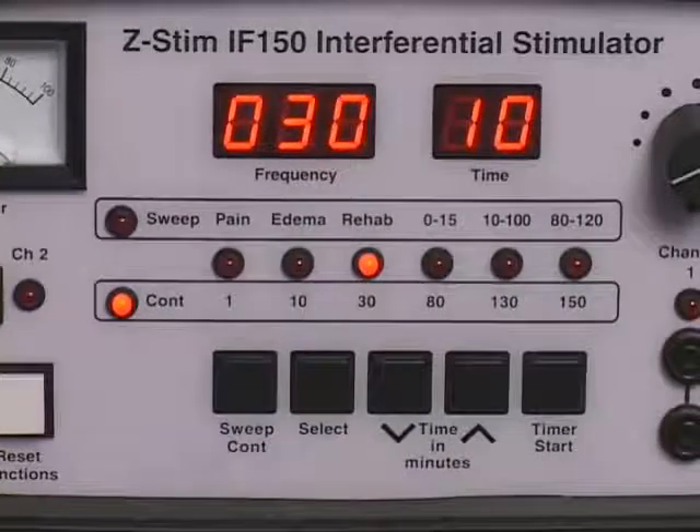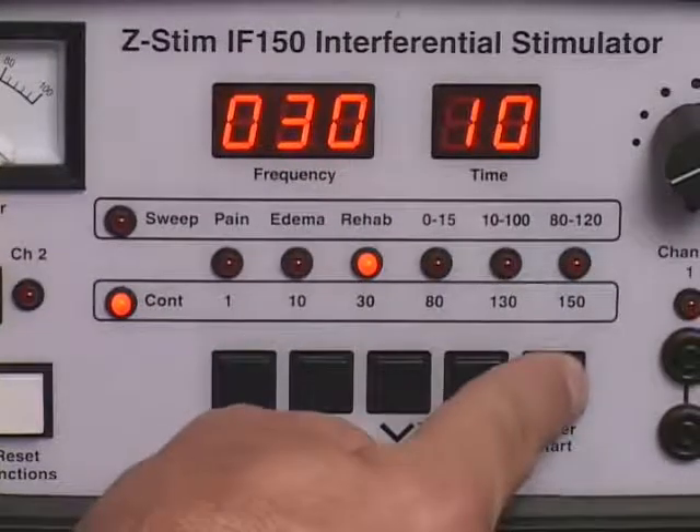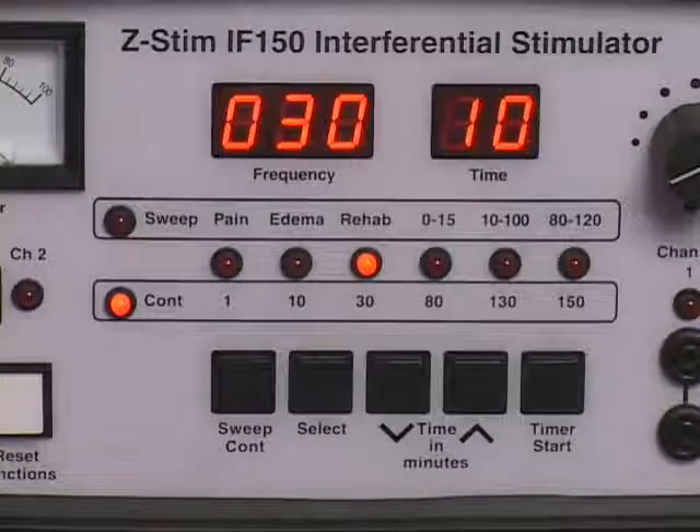Press the start timer control to activate the treatment timer. A flashing decimal point on the power timer display indicates timer countdown in one minute increments.